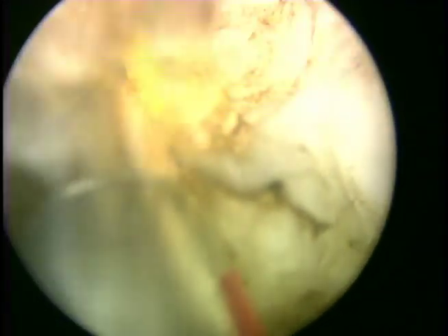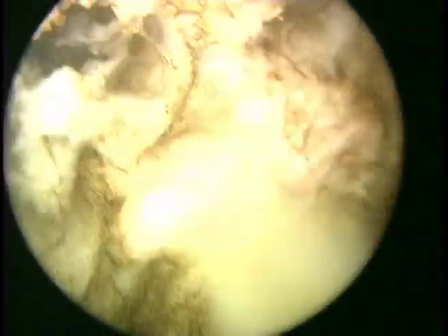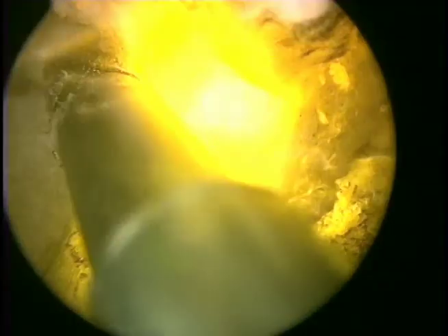Again, on the floor at the 5 o'clock position, there is still that stubborn area of tissue, which requires more treatment to fully remove it, again prompting and allowing for a nicer epithelialization, a more definitive tissue treatment, and we really want to make sure to minimize the amount of inflammation, prevent fibrosis, stricture formation, potentially retreatment of these patients down the road.